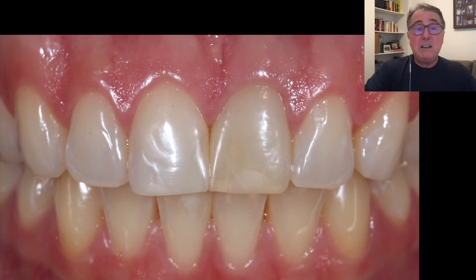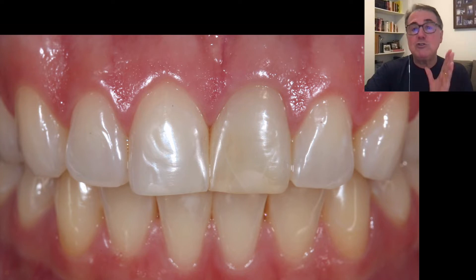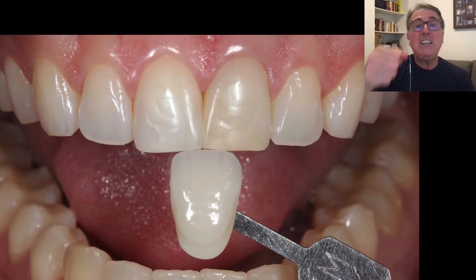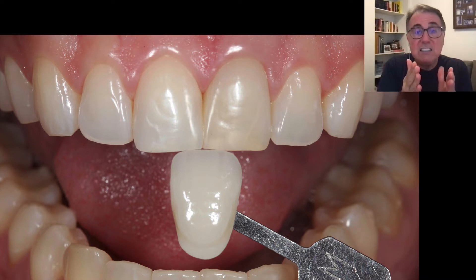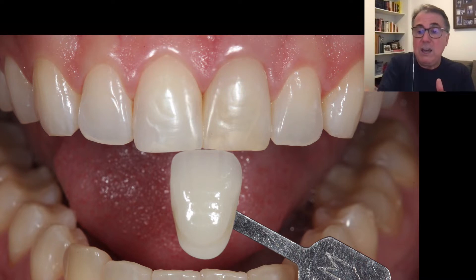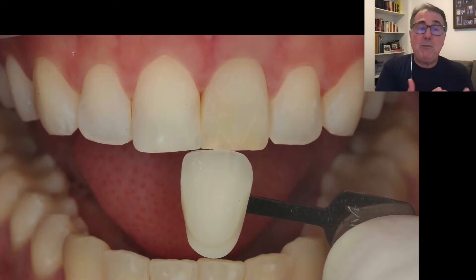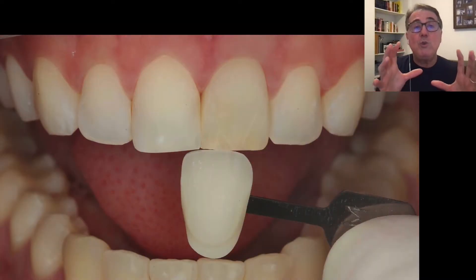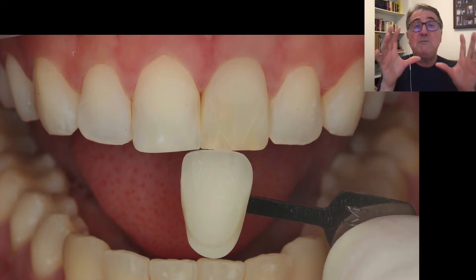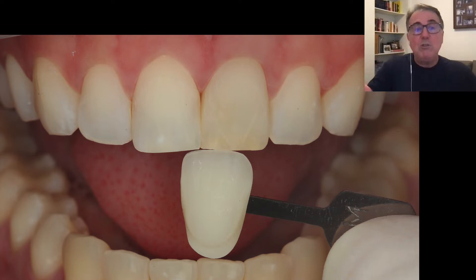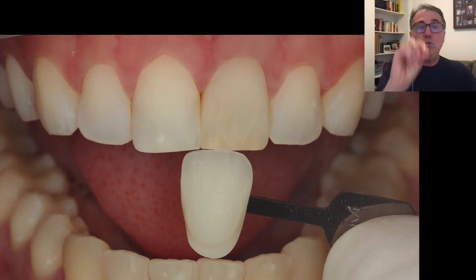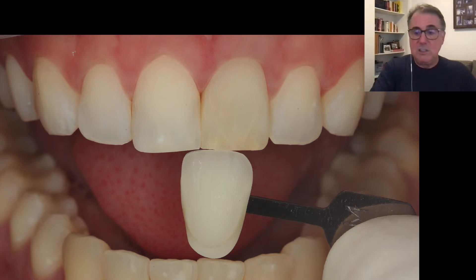First, we need pictures — good pictures to send to the lab with a shade guide, so the technician can see what he has to reproduce. I also find it very useful to take a picture with a polarized filter, where all the scattering light is removed and you have a more plain view of the details of the tooth you want to copy, which is the other central.